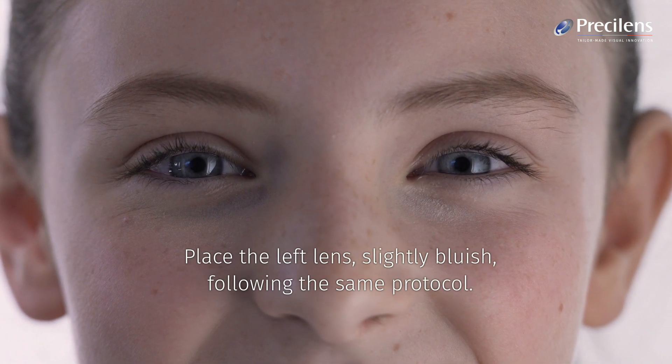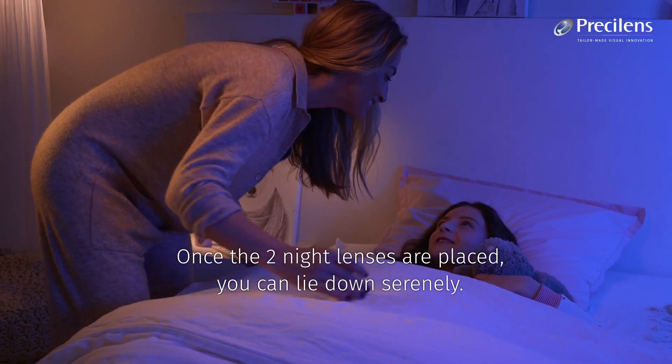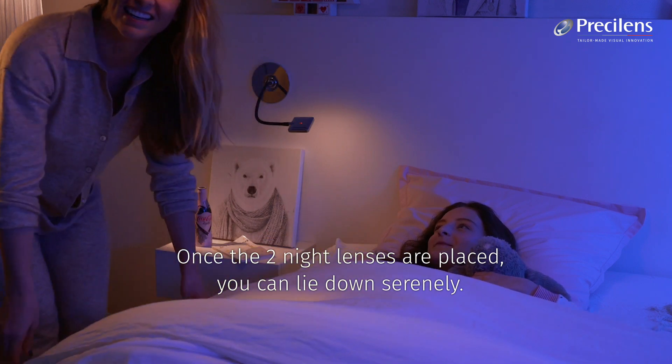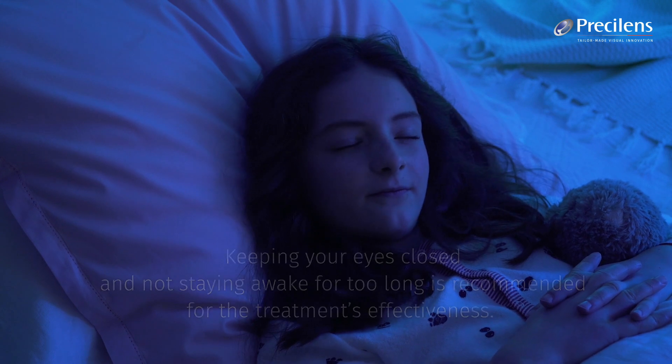Place the left lens, slightly bluish, following the same protocol. Once the two night lenses are placed, you can lie down serenely. Keeping your eyes closed and not staying awake for too long is recommended for the treatment's effectiveness.